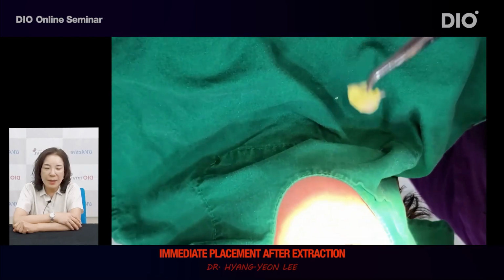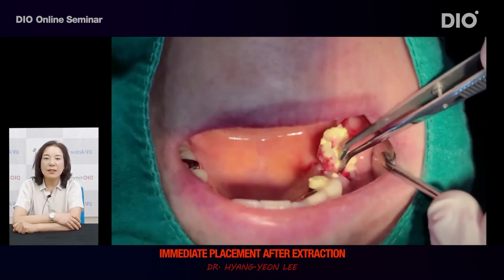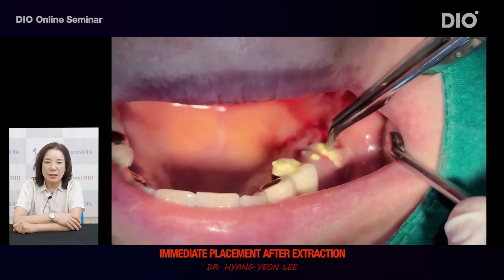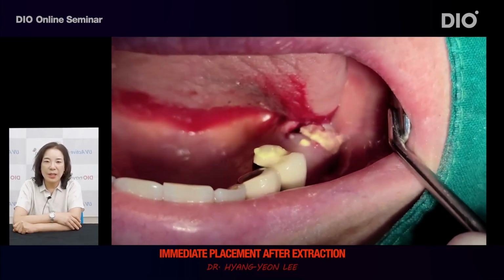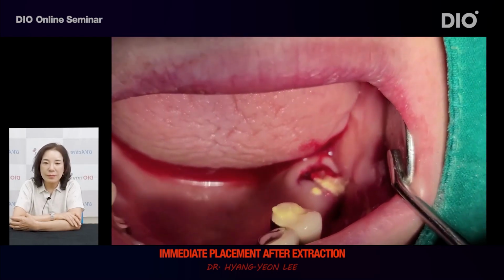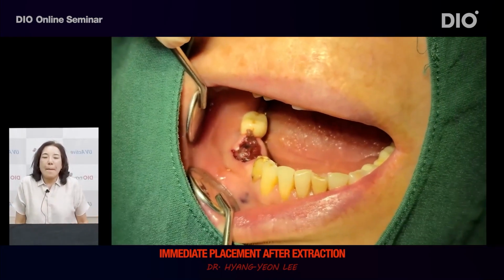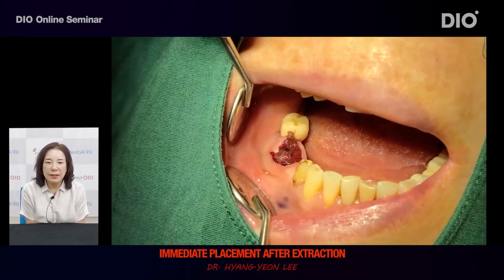Since I wasn't able to take a photo of insertion of doxycycline into this patient, I took a photo of another patient for the insertion of doxycycline. Now, wait until the time for surgery. Remove doxycycline immediately before the start of the surgery.